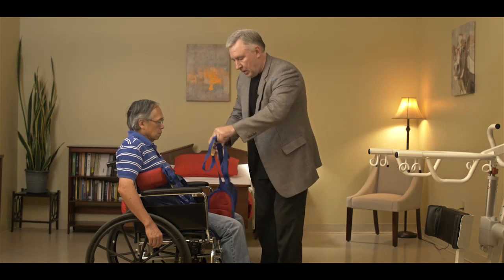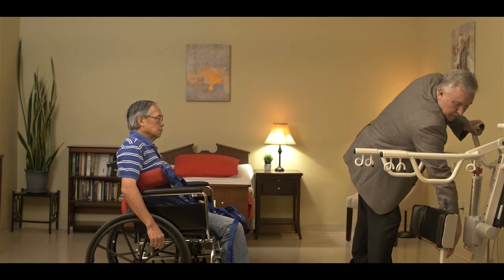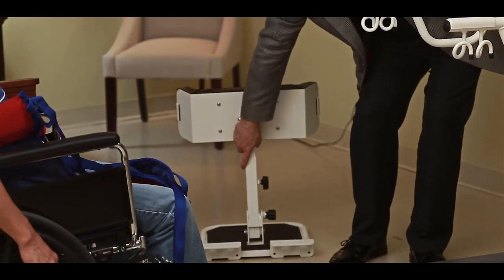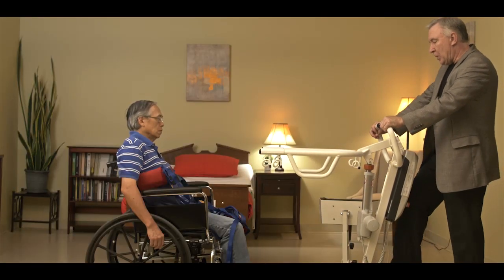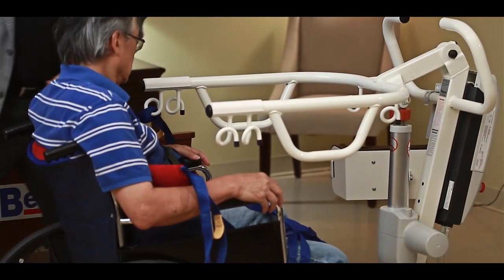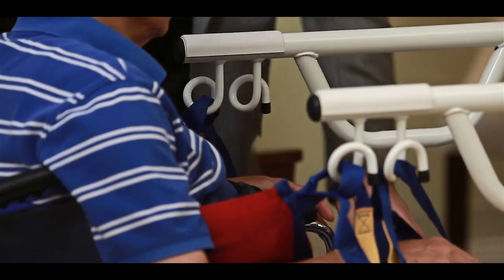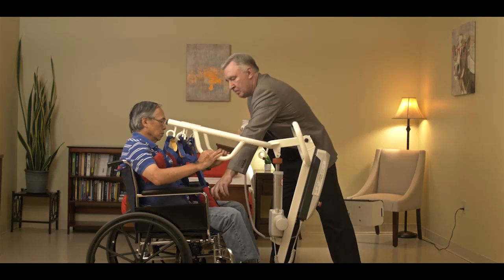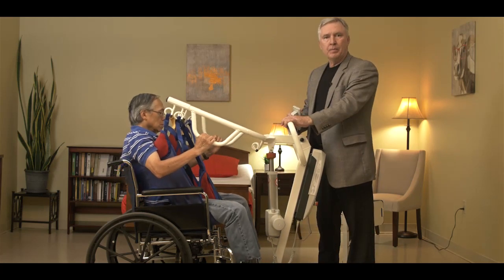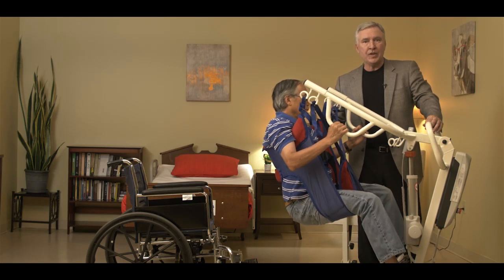Last, crisscross the leg straps. Now prepare the SA product by removing the knee brace and foot plate from the lift. Approach the patient, open the base, bring it up to the person, and lock the casters. Connect the Sani sling to the spreader bar — take the shoulder loops and connect them to the first set of hooks at the lowest loop position, then take the leg loops and connect them to the second set of hooks at the lowest position. Hit the up button on the lift to raise the patient out of the chair. As you can see, the patient is completely supported by the sling. This gives us the ability to transfer a patient who bears no weight using the Sani sling and the SA products.